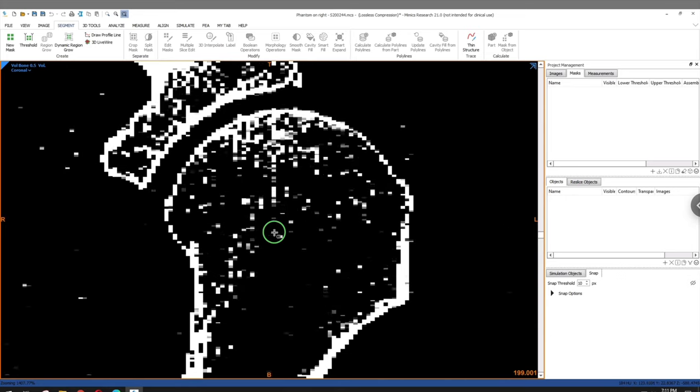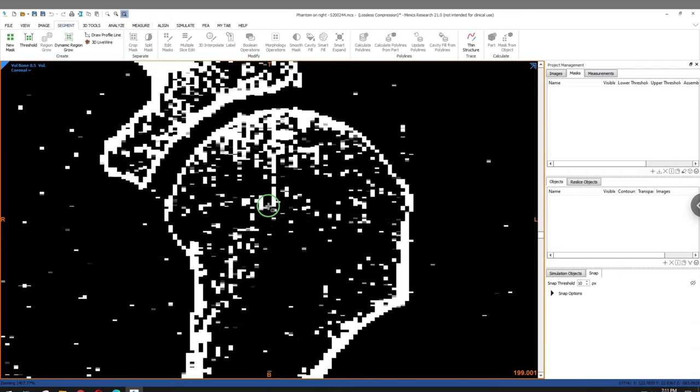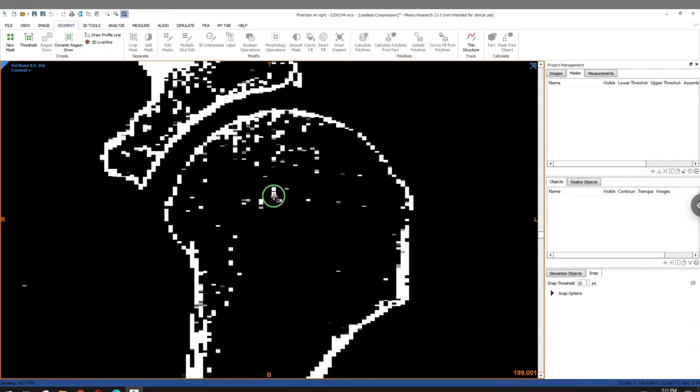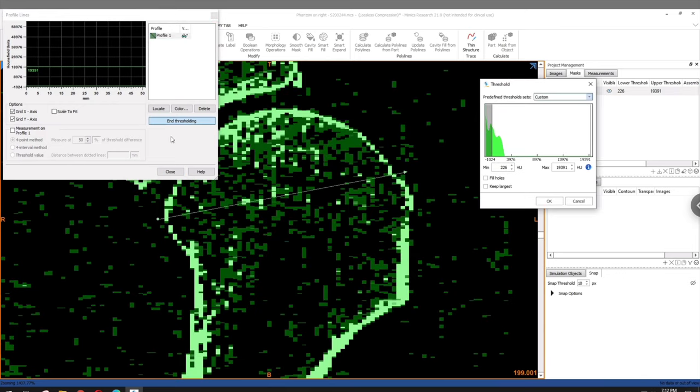Although this process of preloading your contrast settings isn't particularly necessary per se, I would highly suggest it, as it's exceptionally helpful in providing you with a visual preview of exactly what you're going to be targeting to threshold in these next few steps.